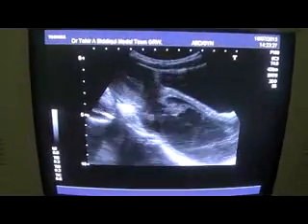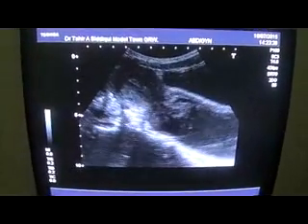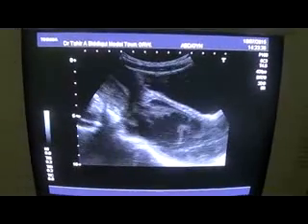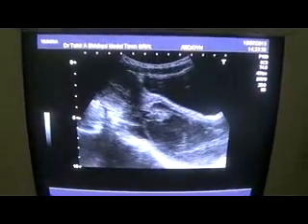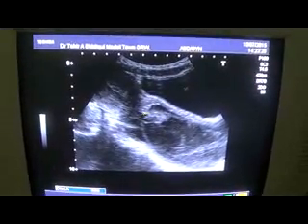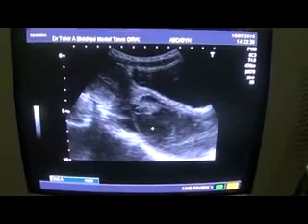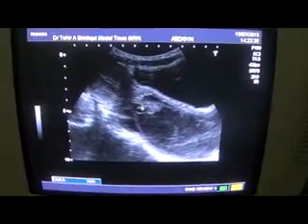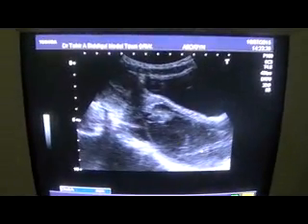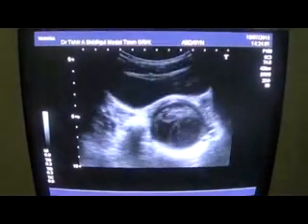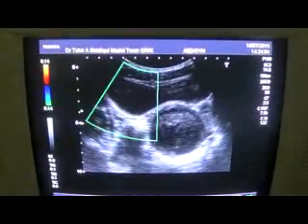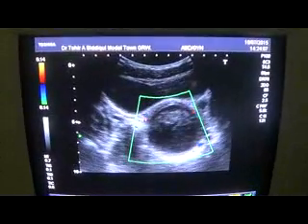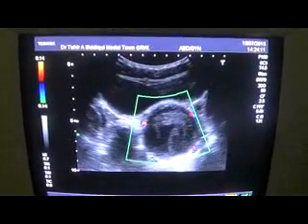As I move upwards, the body of the uterus is traced and the fundus of the uterus is seen relating with this dilated area. Note that dilation as well as the echoes — these are all echoes, this is all bleed, in fact different-strength echoes. This is developing into a clot. There is no blood supply seen within this dilated vagina.